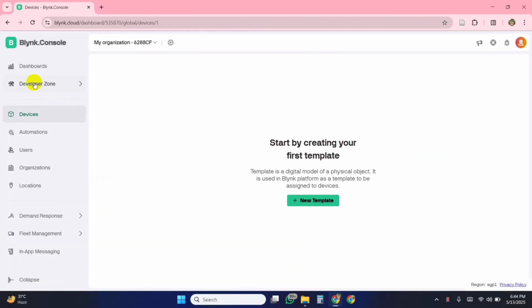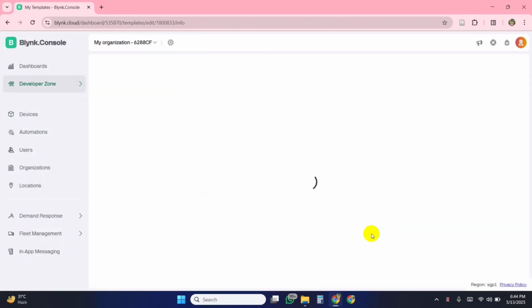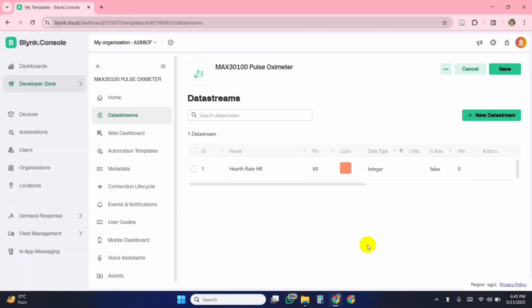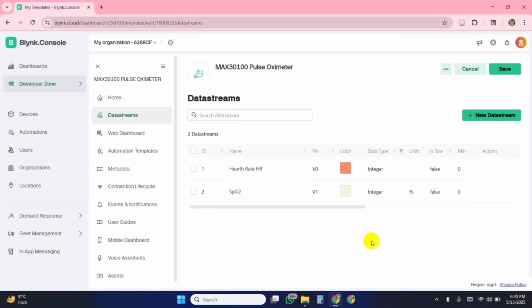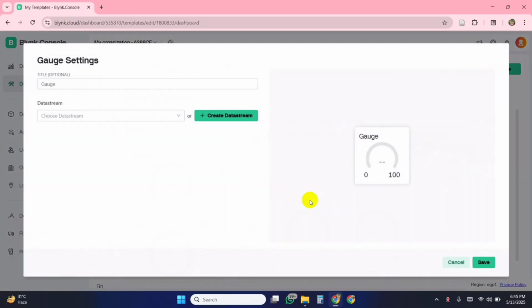Next, let's set up the Blynk web dashboard. Head over to the Blynk website, create an account if you haven't, and build a new template from the developer zone. Add two virtual data streams for pulse rate and oxygen level, and use gauges in the web dashboard.